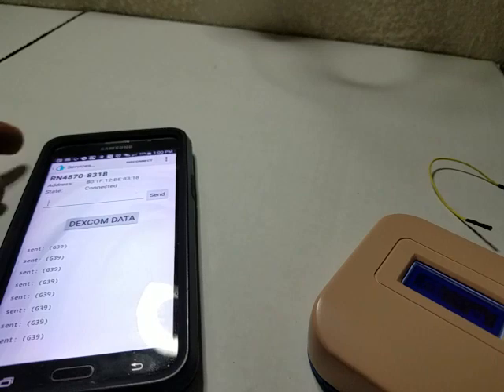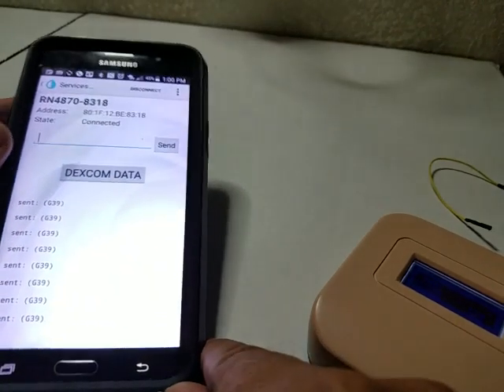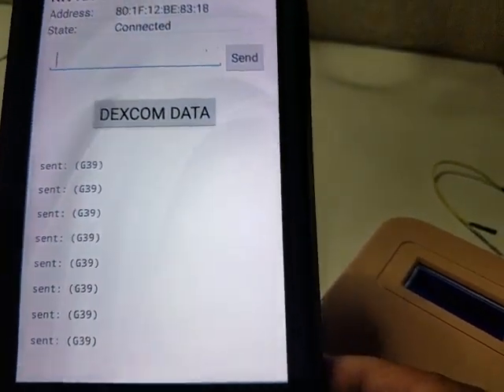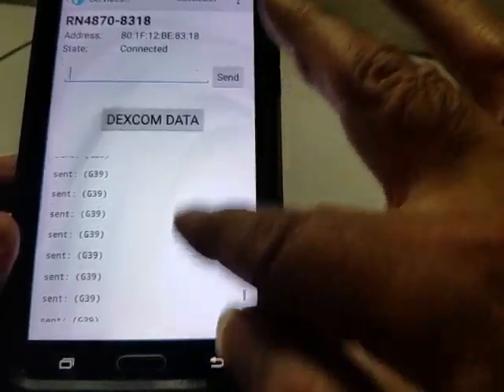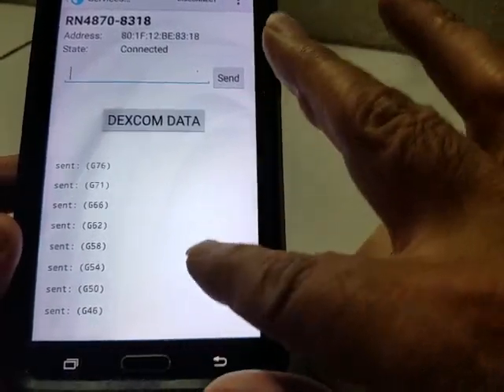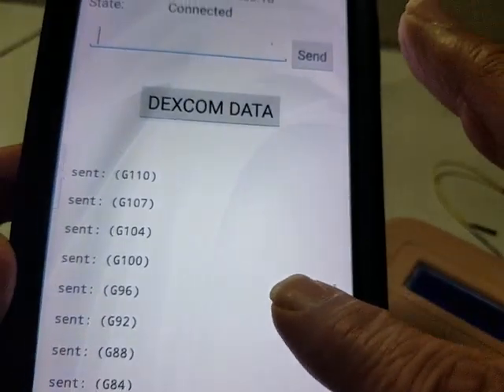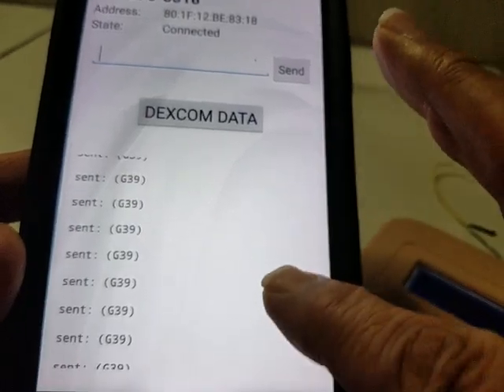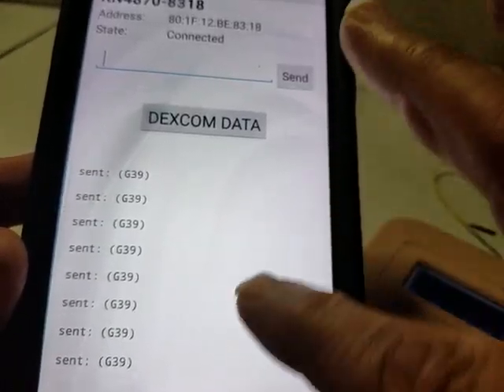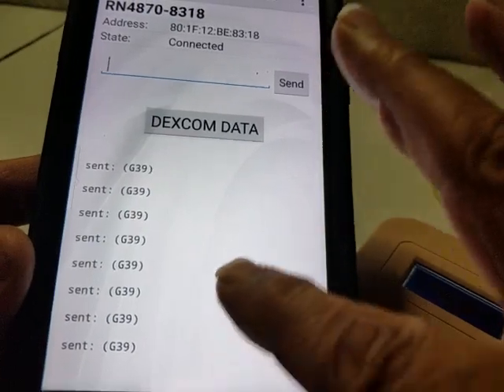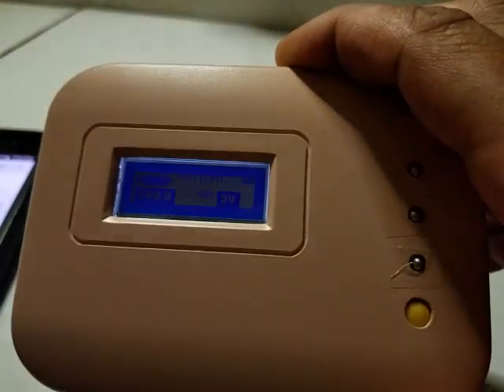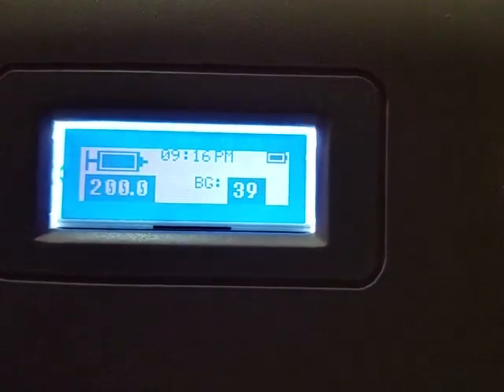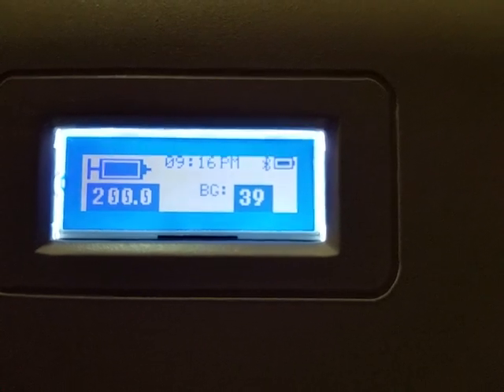We're coming back a little time later. As you can see, the numbers went all the way down to 39. Scrolling up, we paused and waited for the system to run some numbers — this is what the number looks like. Going back to the pump to take a look: 39, no insulin on board.